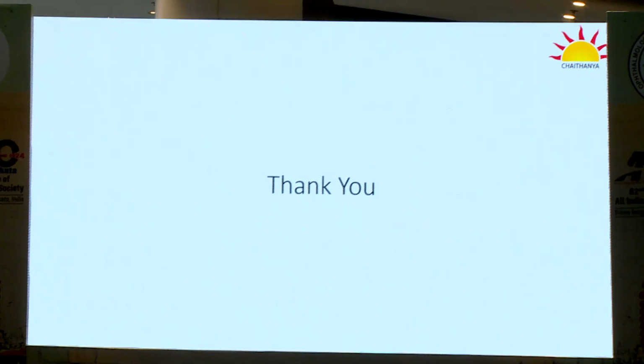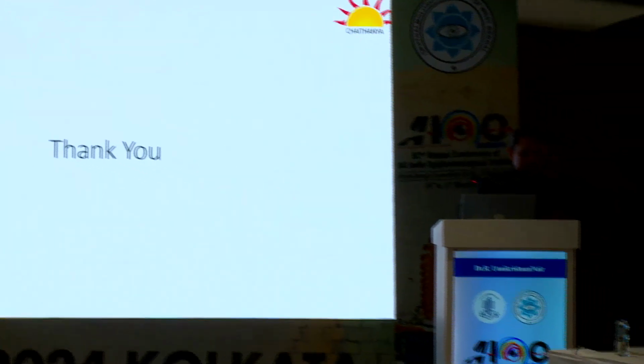So I just have a question for you. I think now we are having new therapies for dry macular degeneration, like Syfovre and the complement-based. So based on this upcoming exciting new therapy, where do you see the role of autofluorescence, and specifically the difference between blue and green? Because I know Heidelberg has both these features.